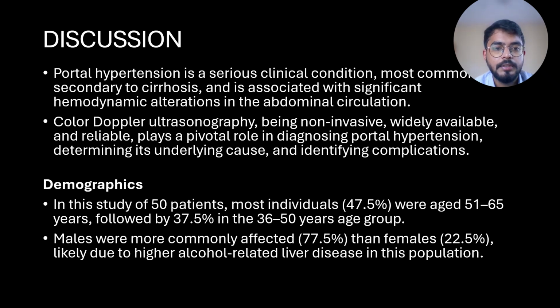Discussion. Portal hypertension is a serious clinical condition, most commonly secondary to cirrhosis, and is associated with significant hemodynamic alterations in the abdominal circulation. Color Doppler ultrasonography, being non-invasive, widely available, and reliable, plays a pivotal role in diagnosing portal hypertension, determining its underlying cause, and identifying complications.